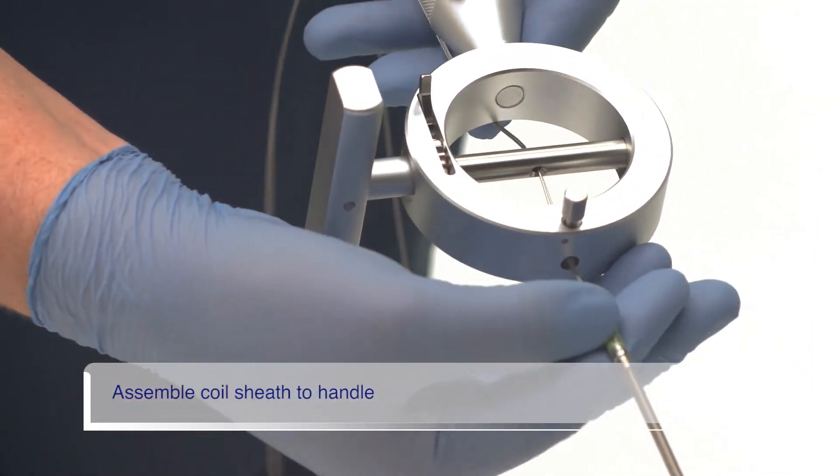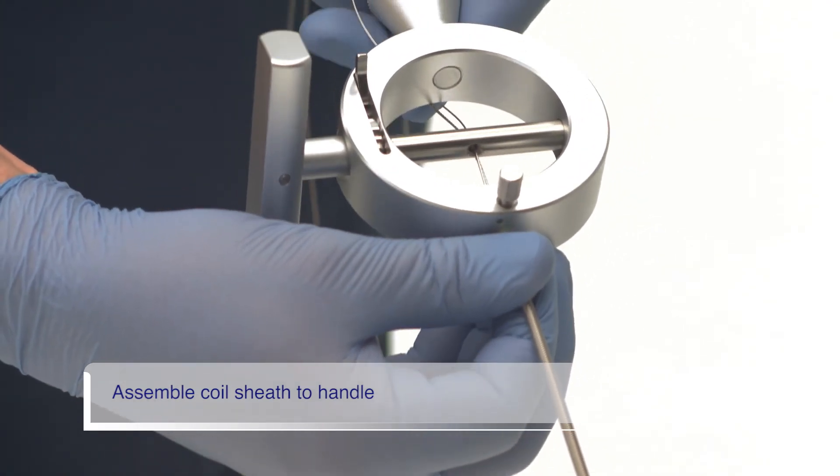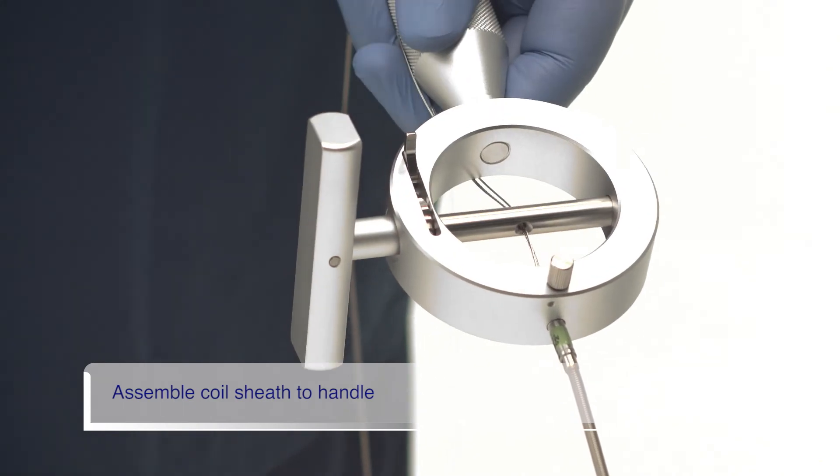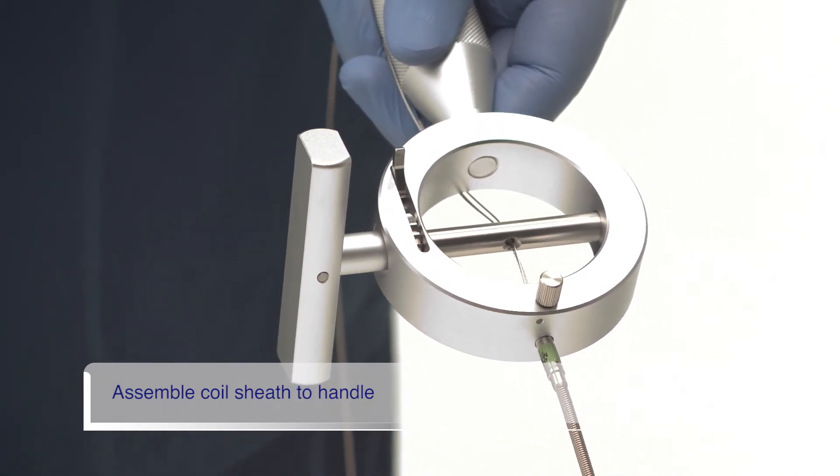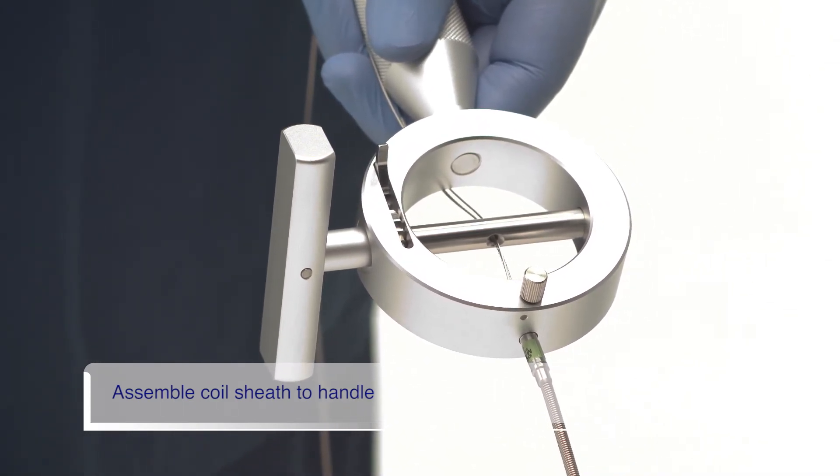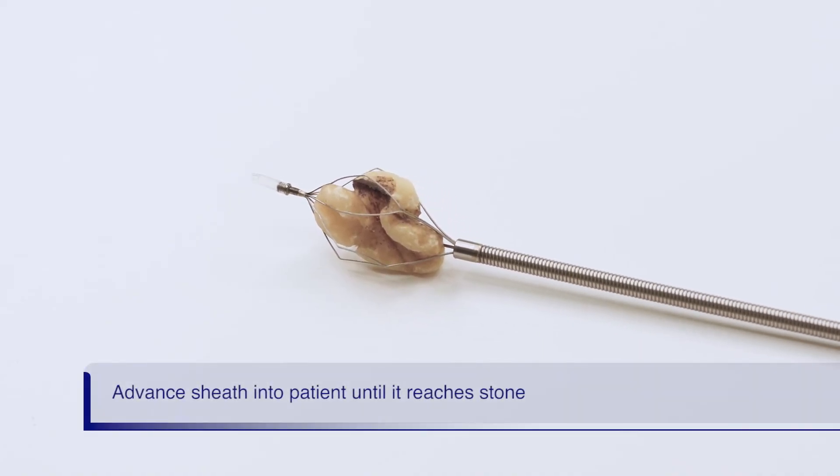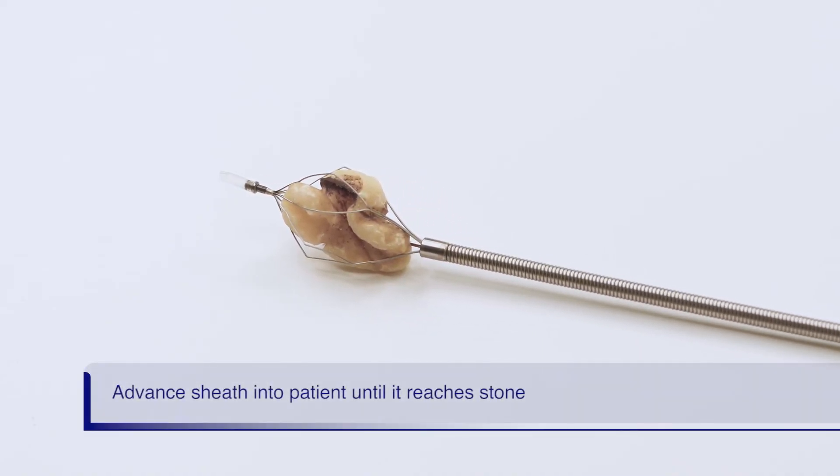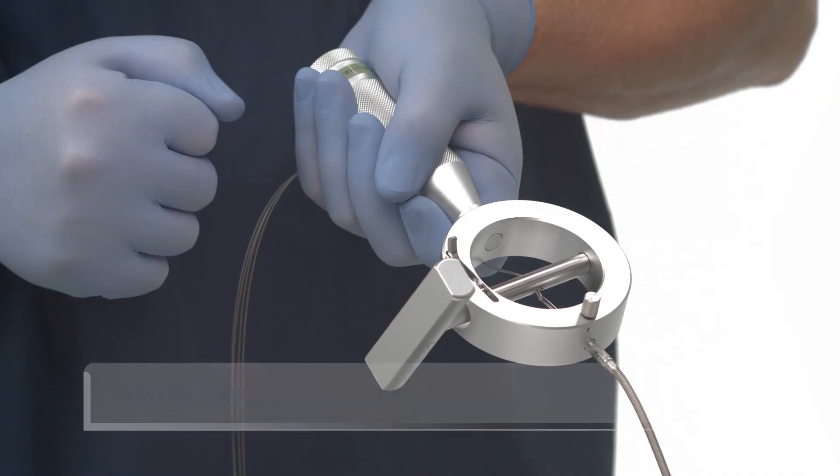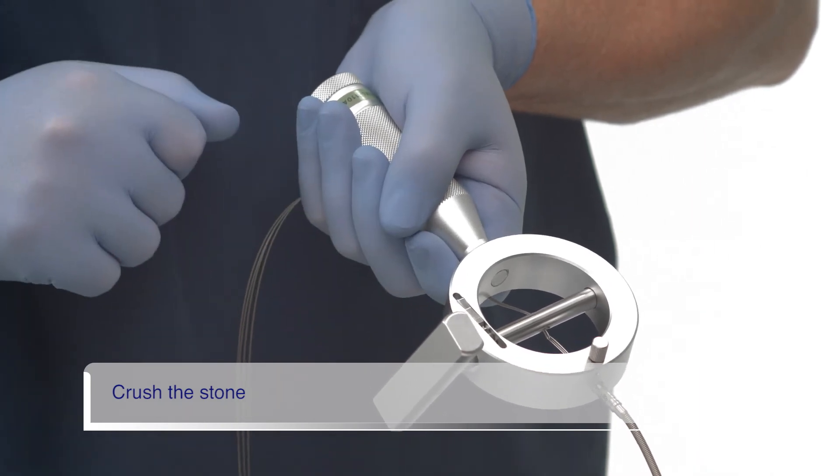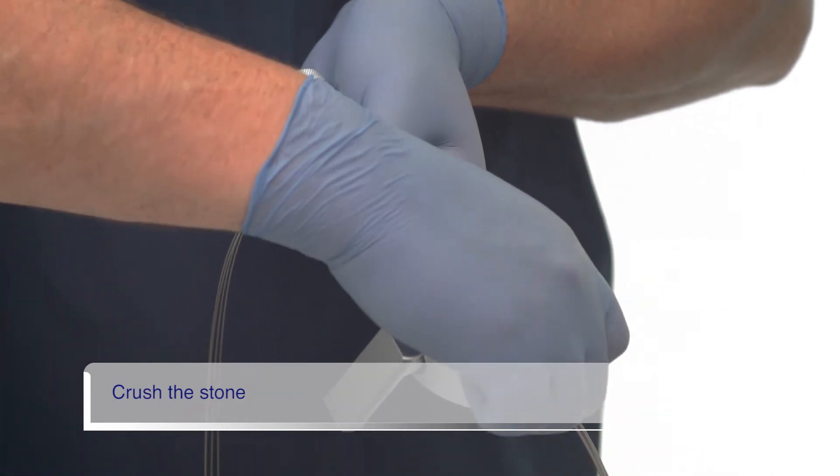Insert the green proximal end of the coil sheath into the hole at the top of the emergency lithotriptor handle. Lock the sheath in place by turning the thumb screw clockwise as shown. Confirm the sheath has reached the stone. Ensure that the ratchet is in the locked position and confirm the coil sheath is locked into the handle.